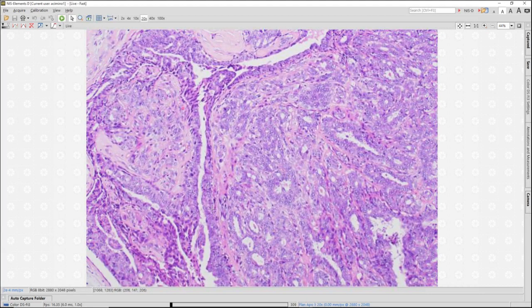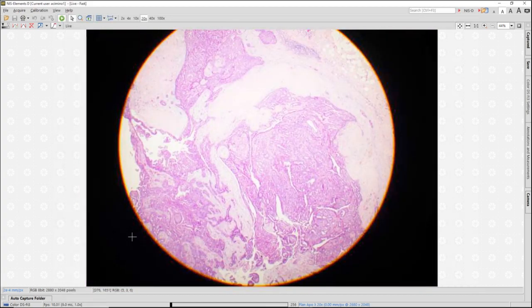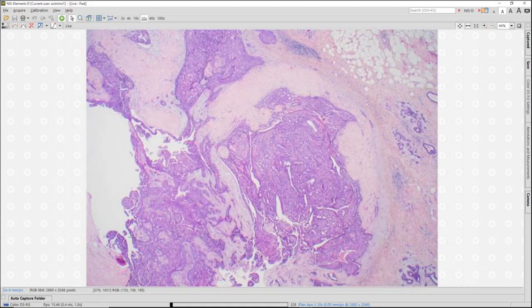In the intraductal proliferation, I see the duct space. I see the fibrovascular cores. I see the myoepithelial cells investing the cores as well as around each of these glands. And I have the features of usual hyperplasia within the epithelial component. So although we have a lot of features here, we can break them down and say, yes, this is an intraductal papilloma with sclerosis, adenosis, and florid usual hyperplasia.